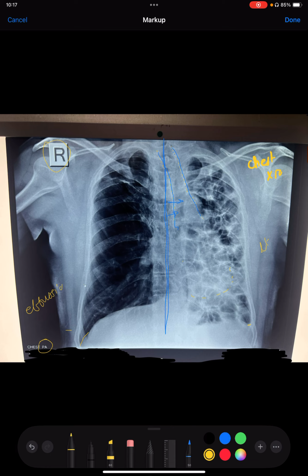So we very well know that in lung pathology, effusion pushes the trachea, a tumor, mass, or solid structure pushes the trachea, whereas fibrosis and restrictive lung diseases, where there is shrinking of the lung parenchyma, pull the trachea towards the affected side.